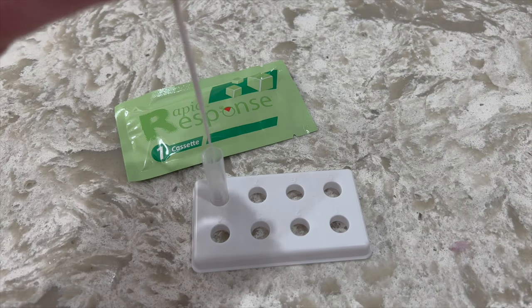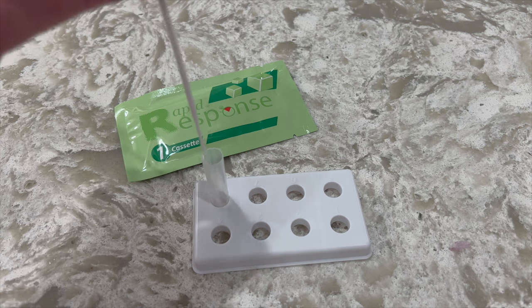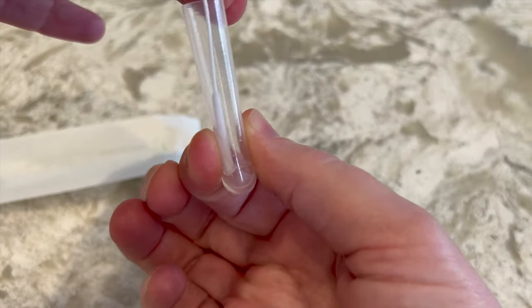After completing the swab of both nostrils, insert the swab into the extraction tube. Swirl the swab, mixing well, and squeeze the swab 10 to 15 times by compressing the walls of the tube against the swab.